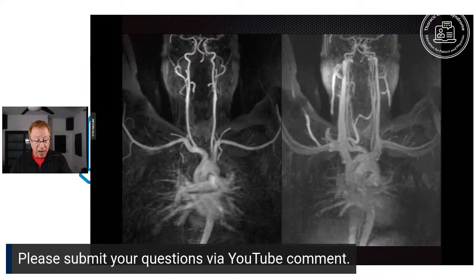Now, if we give contrast, on your left side, you'll see a beautiful MR arteriogram. This is with contrast, but the contrast is not nearly as bad for the kidneys. And we don't need to use any X-rays for this. This is done in a magnetic field with no X-rays. And the images are darn nice. If you look on the right side, it's the same patient. We just waited longer, and then we took pictures and have a venogram as well. So we've got soft tissues, we've got bones, we've got arteriogram, we've got venogram.